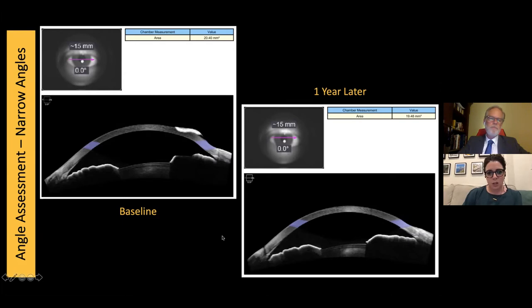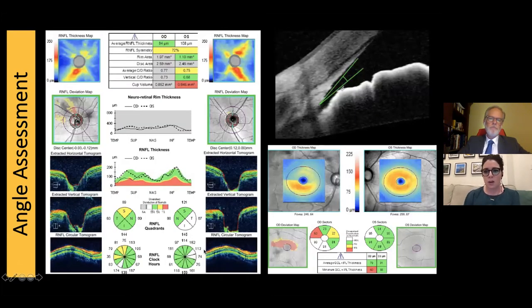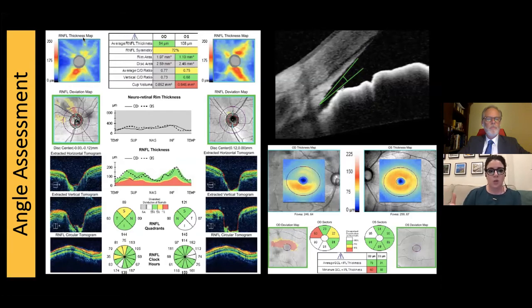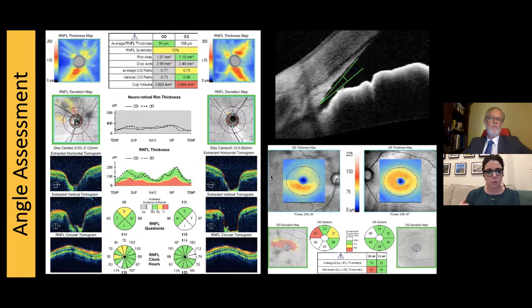Another important point with narrow angle patients: it's really important to run a nerve fiber layer and ganglion cell analysis on them. With this patient, running the nerve fiber layer reveals a big asymmetry between right and left overall average nerve fiber layer thickness. You can visualize significant superior nerve fiber layer thinning. We've gone from having this patient as a narrow angle suspect to proving she has nerve fiber layer damage, also seen in the ganglion cell analysis. She's now a chronic angle closure glaucoma patient.